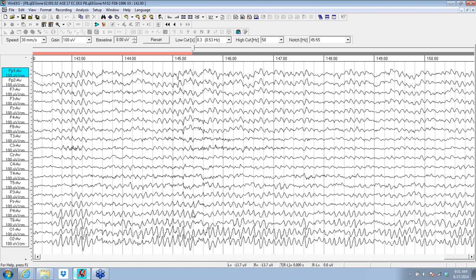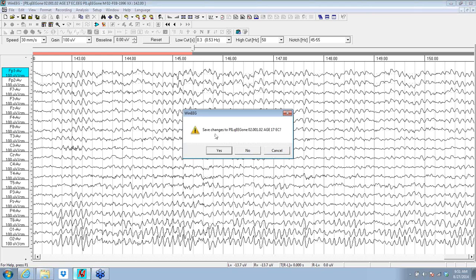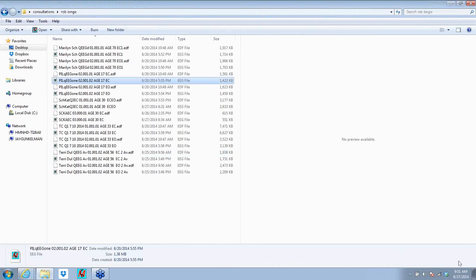Anyway, this is the 17-year-old, and we've got that right temporal lobe with the hypercoherent alpha up front, which looks like it's basically just field effect, which is why you get up to the 0.9, which is questionably artifactually high. It's high because it's a field effect, a generator that's actually projecting to the back being picked up in front from a deep dipole. So that's my quick look through the second client, and we've got about 9 minutes left.